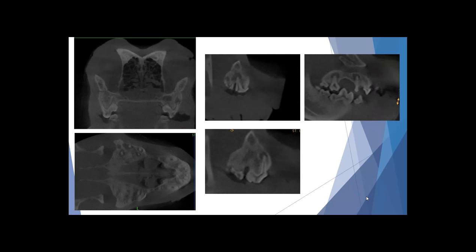Here are endodontic lesions in still view — you can appreciate the lucency present in three dimensions and look at it from every angle to identify where the issue is, how significant it is, whether it's measurable, and how to approach the patient. With that, I'll take any questions you have. Thank you everyone for attending this evening — hopefully this was at least somewhat beneficial and gave you a feel for whether Cone Beam CT is something you may consider adding to your practice.